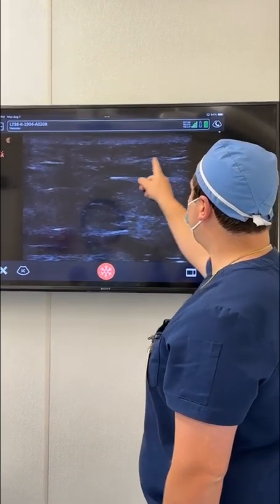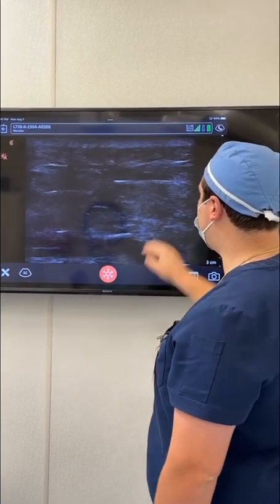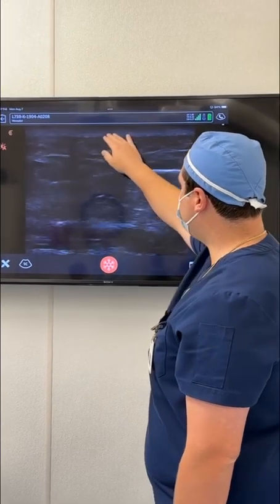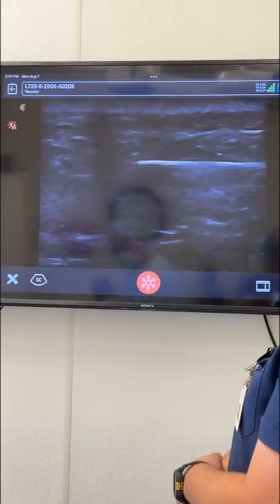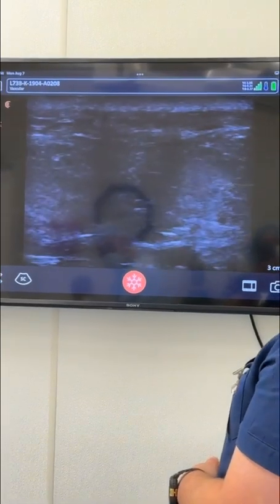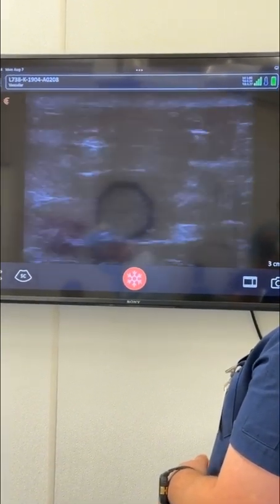This is the superficial gluteal fascia, this is the skin, and this is the deep gluteal fascia — so he's in the correct area. The fat is going to go into this subcutaneous space. I'm going to give it a bolus so you can look at the tip of that cannula and see the fat going in.